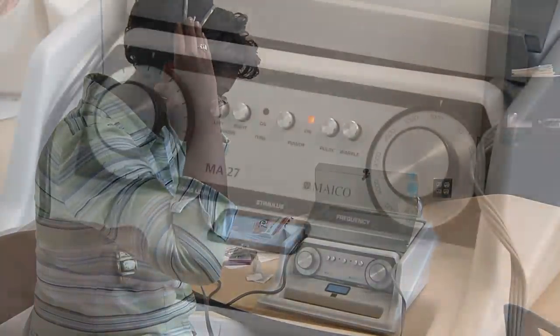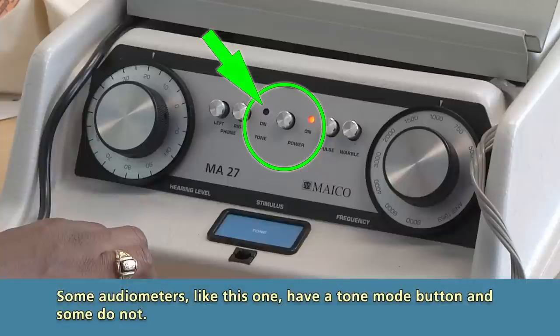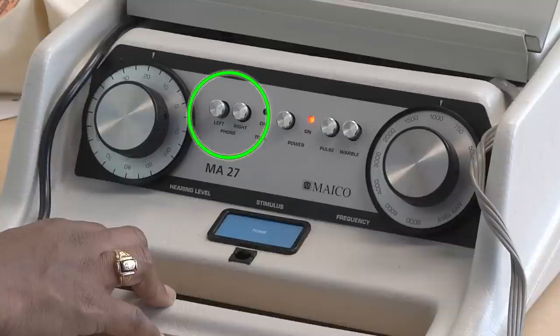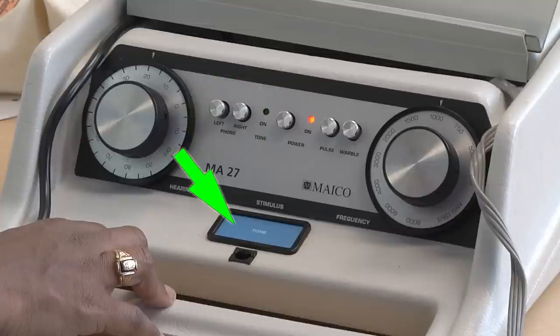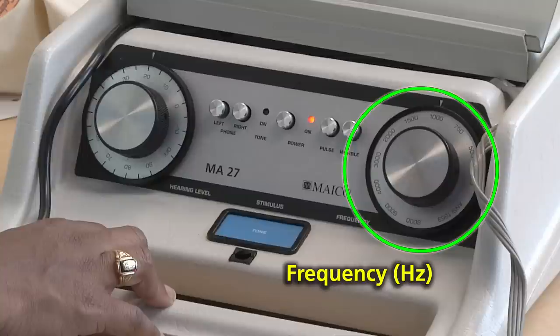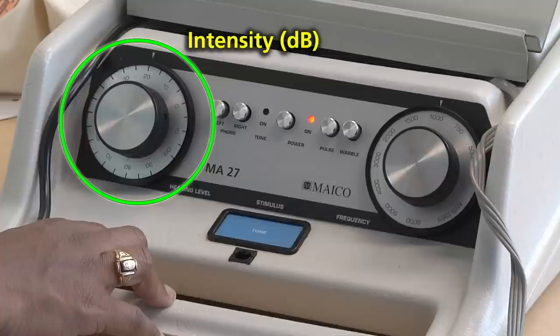Conduct a listening check by following these steps. Turn the power switch to on. Leave the tone mode at norm off — this means the tone will not sound until the button is pressed. For some audiometers, the right and left ear buttons are marked; for others, the output for the right ear is red and the output for the left ear is blue. The tone button produces a tone when pressed. There are two dials: one controls the frequency, or pitch, measured in hertz (Hz), and the other controls the intensity or loudness, measured in decibels (dB).